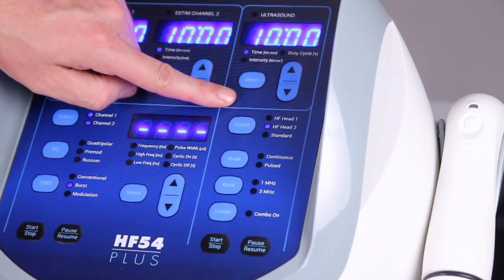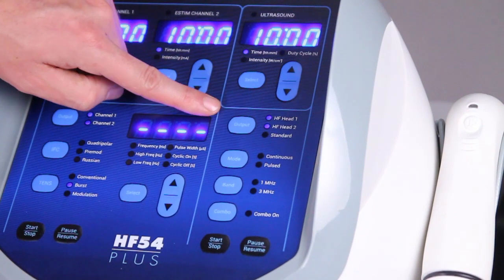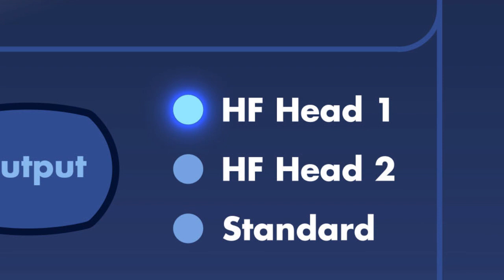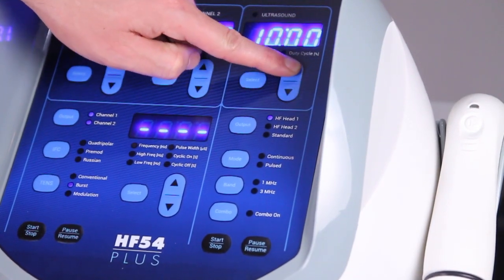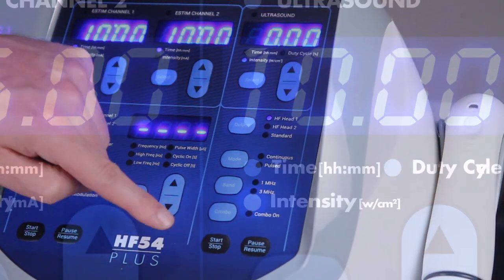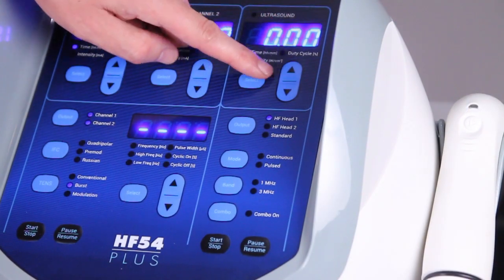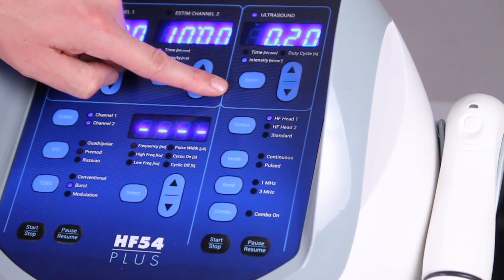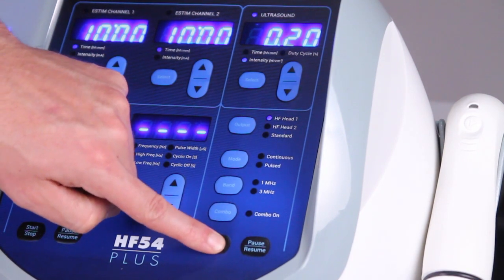To treat with ultrasound, you may select one or two sound heads at the same time. To use a single sound head, select HF head number one, then adjust the time using the up and down arrows. Press the start stop button to begin the treatment. The intensity indicator will light automatically as the treatment starts. Ultrasound intensity can only be adjusted during treatment using the up or down arrows. Press the start stop button at any time to stop the treatment.